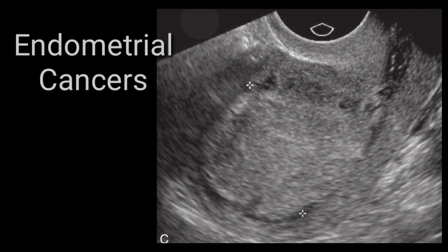Not all cancers look like this. There are different varieties of endometrial cancer, which I will explain in the next or a separate video. But for example, if you come across such a thickened endometrium, always consider endometrial cancer. Before going to diagnose the cancer, you must put the Doppler signal on it and look for the vascularity. If it is vascular and if it is thick, consider this could be endometrial cancer.